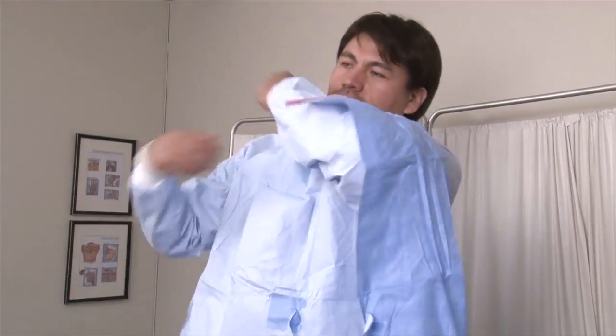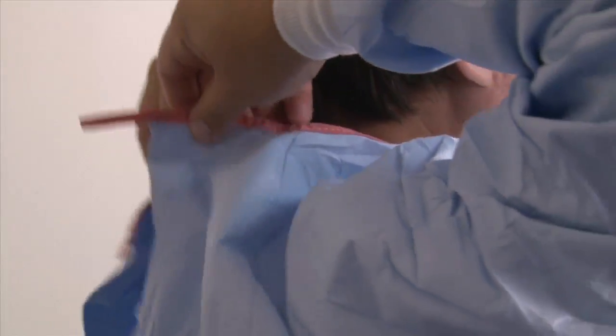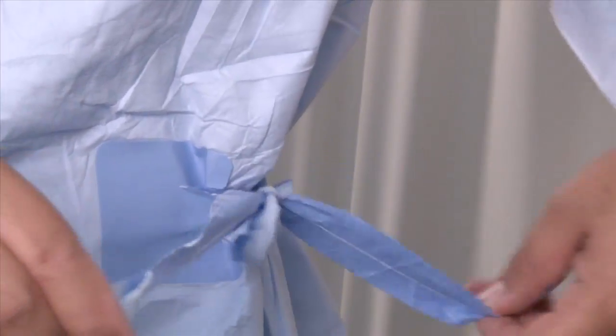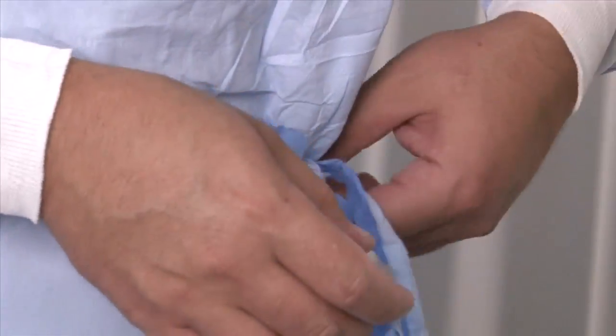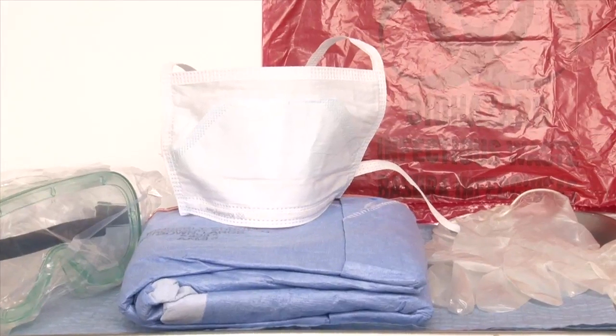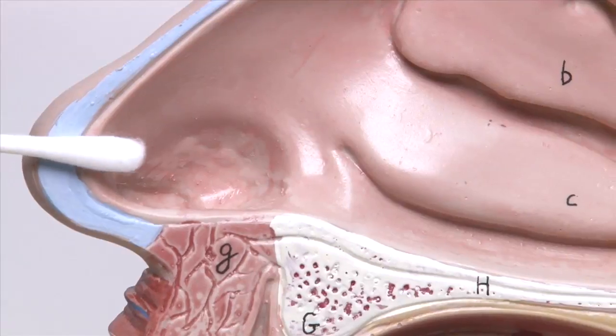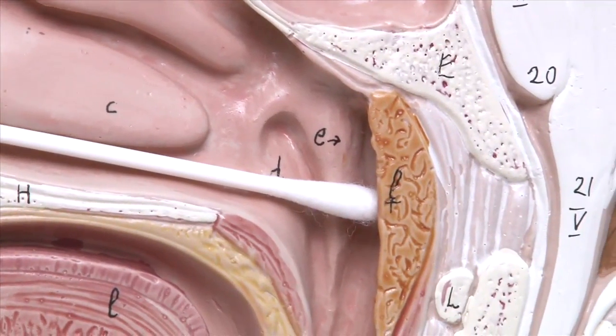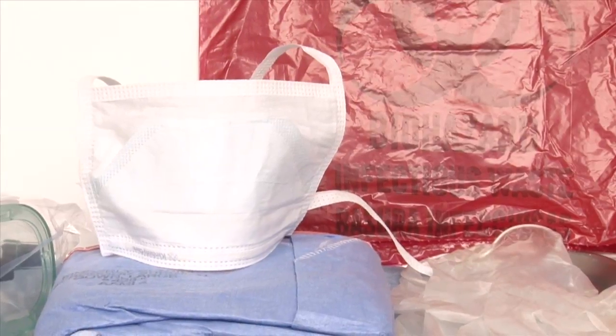In this video, we will demonstrate the appropriate use of Personal Protective Equipment, PPE, including how to put it on and how to take it off. First, we will demonstrate the use of full PPE, and second, we will demonstrate PPE to be used for collection of oropharyngeal and nasopharyngeal swabs and nasal aspirates.